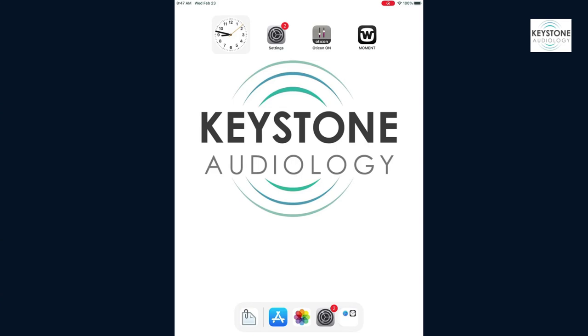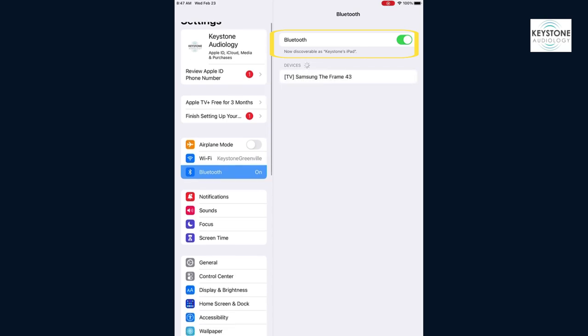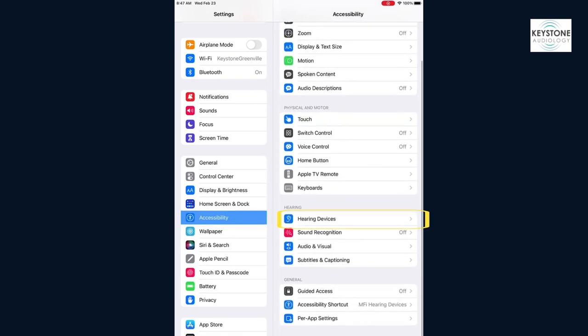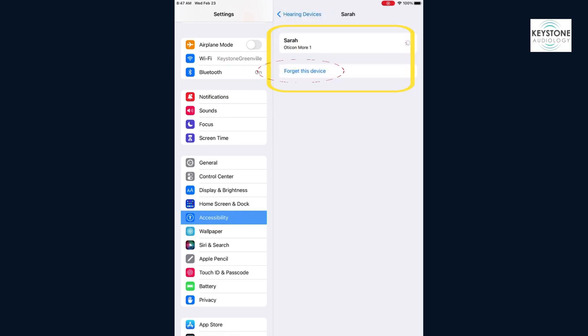First, we want to unpair your hearing aids. Go to Settings and make sure that your Bluetooth is turned on. You want that toggle to be green, which will indicate that Bluetooth is turned on. Then scroll to Accessibility, where you will find Hearing Devices. Click on Hearing Devices. You'll see your name and your hearing aids at the top, which you want to click. Then you want to hit 'Forget This Device.'